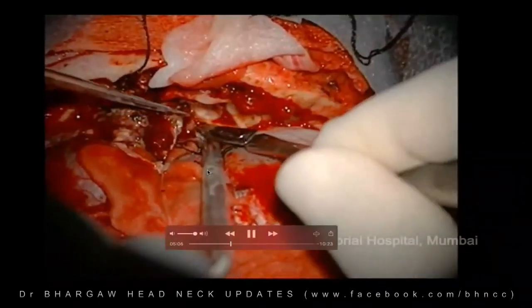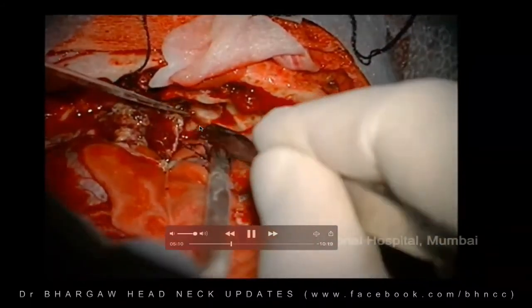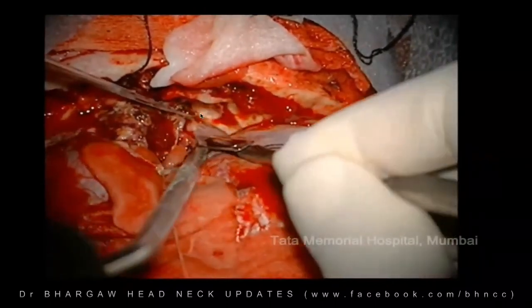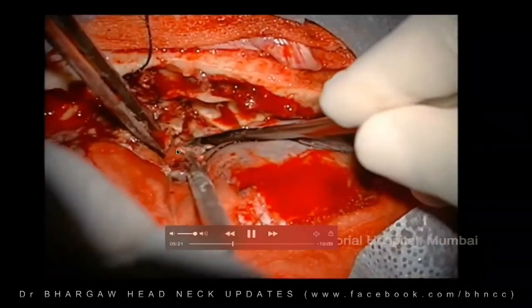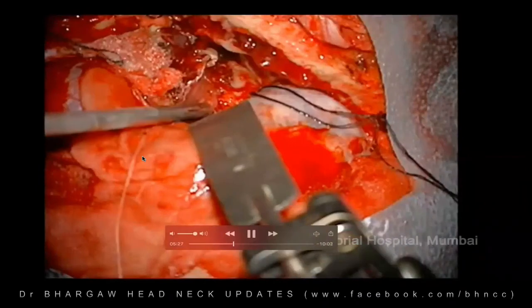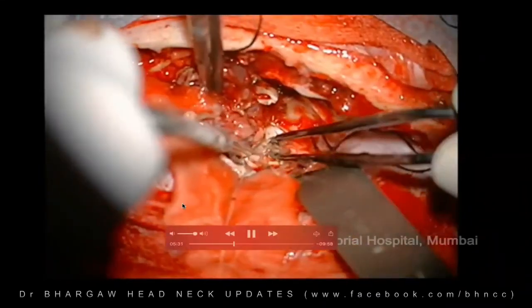And this is the lateral margin on the dura on the right side. They're just dissecting it out and incising the dura there and getting it out. That's the dura being excised laterally there. And the posterior aspect of the dura is being excised here, looking at having direct control on the tumor. So that it's at the dura now.